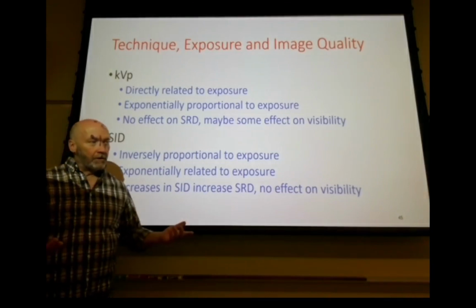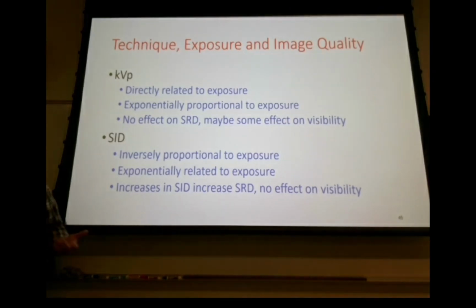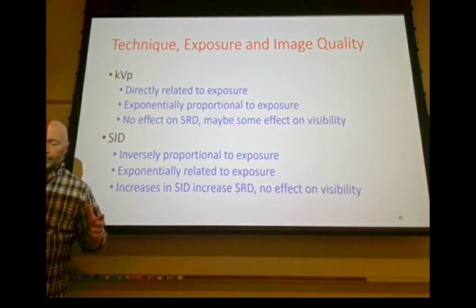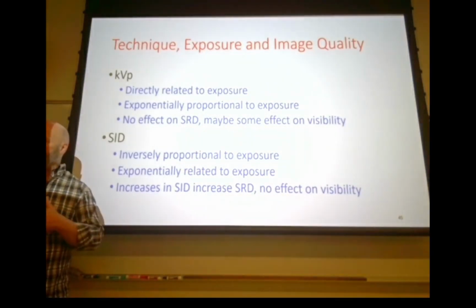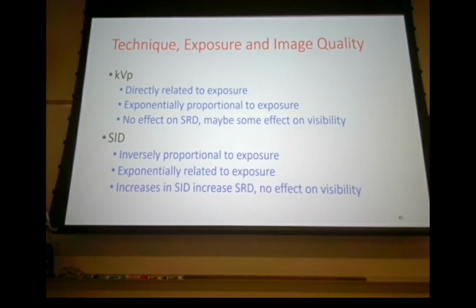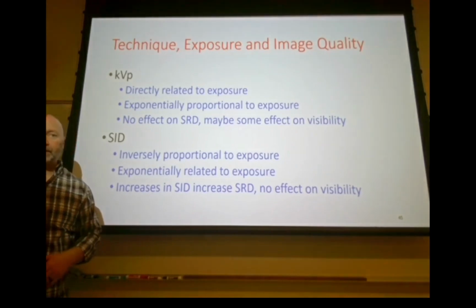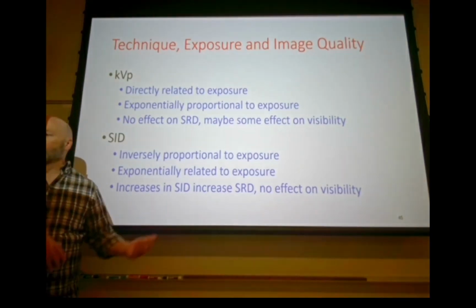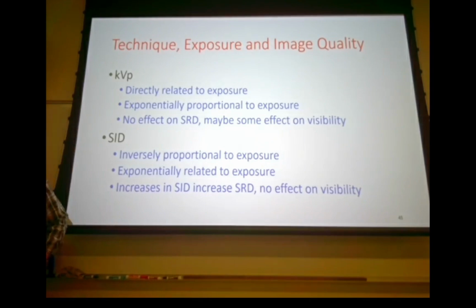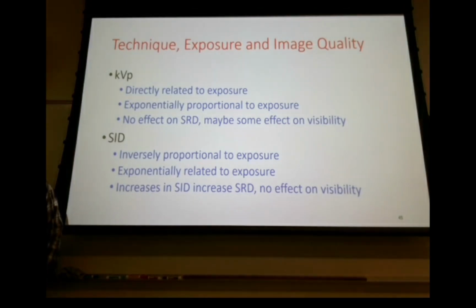So again, on a slow day, you can mock up a patient. I've mentioned this before. Make sure your patient has plenty of water. If you can, find one of those big square basins and put some water in it, and then put something that would simulate bone. I'm not talking about plastic skeleton bone, because it's plastic and easy to penetrate. Find something else. Even if you bring something from home, like if you're having ribs one weekend, bring a rib up there. Make sure it's clean. Throw it in the water and make an exposure.